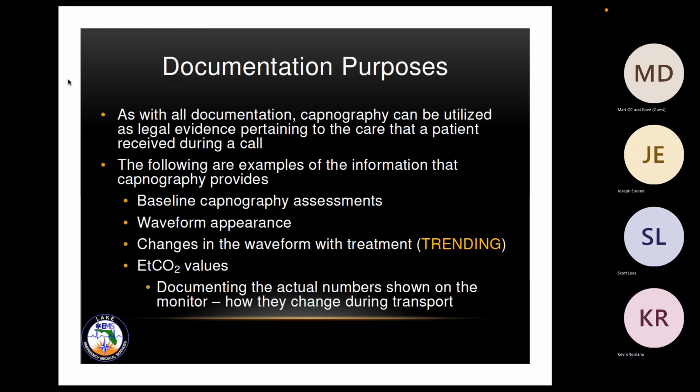Documentation purposes: with all the documentation, capnography can be utilized as legal evidence pertaining to the care a patient received during a call. The following are examples of information that capnography provides. One, a baseline capnography assessment. It also gives you waveform appearance and changes in the waveform with treatments. So it's called trending. End tidal CO2 values as well. All this good information.